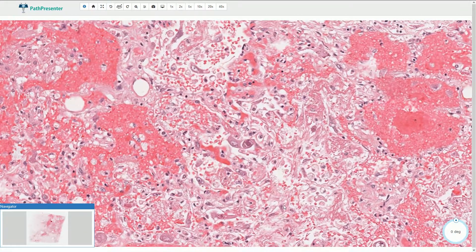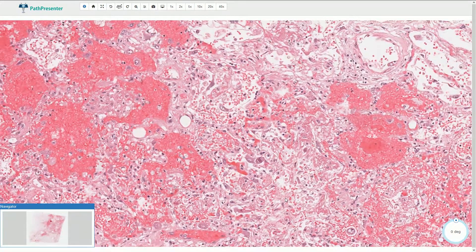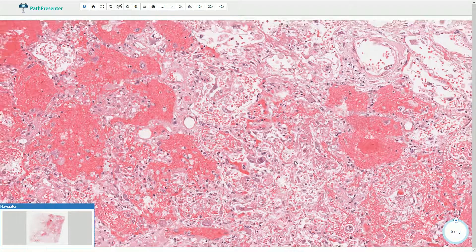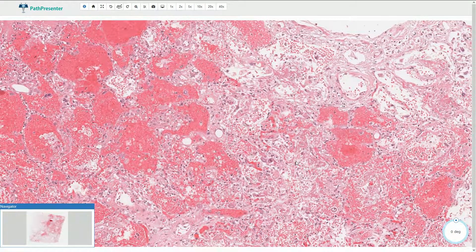CMV can infect multiple organs, but cytomegalovirus pneumonia is probably the most common. Severe cases can lead to diffuse alveolar damage, as we saw in this case. CMV pneumonia can be fatal in immunosuppressed patients.